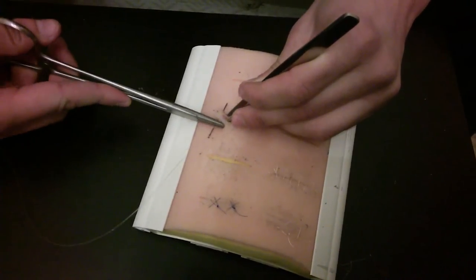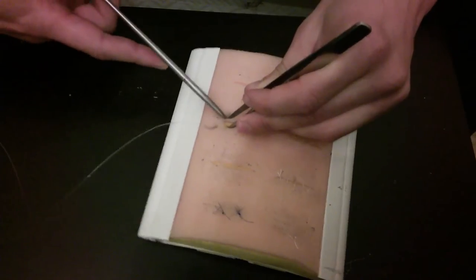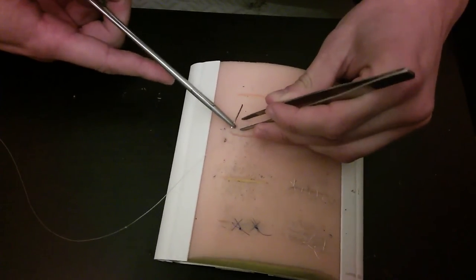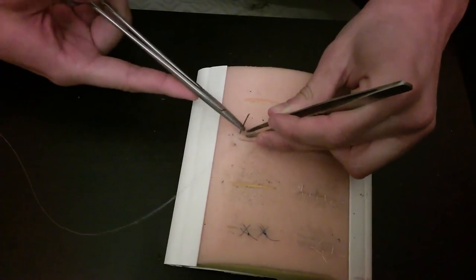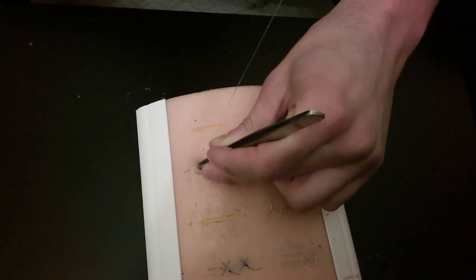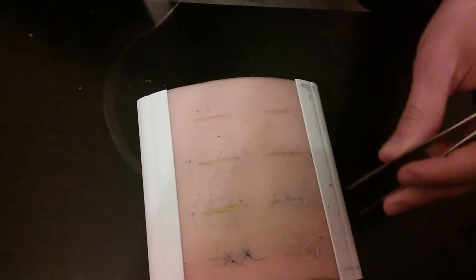We will go in, come out. Now, in this suture you cannot touch the needle, and we are going to tie a simple interrupted here.